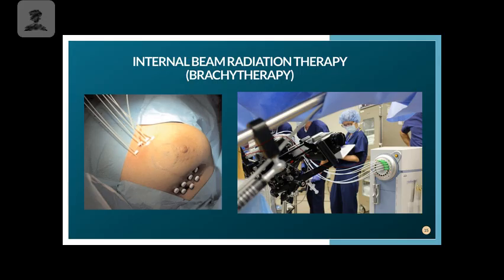So these are very invasive procedures compared to external beam, but they can potentially provide greater treatment options for certain types of cancers. Not everyone is going to qualify for brachytherapy, and not everybody even has access to it, because you have to have the surgical suite and be in a certain location. So, not every place will have this.